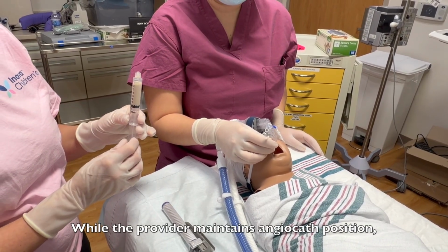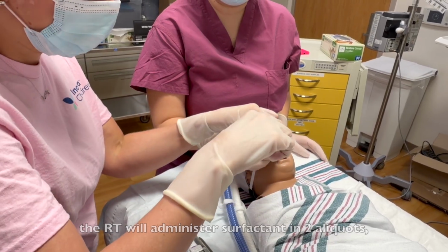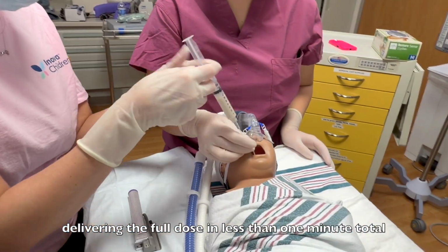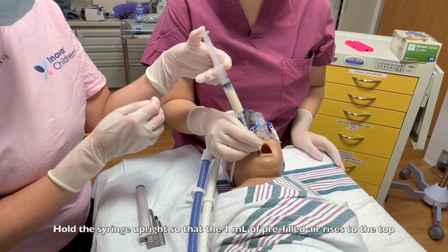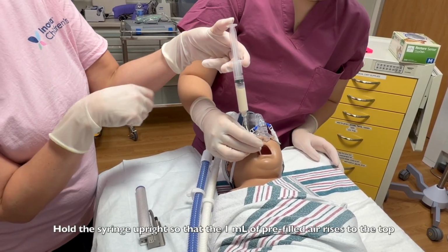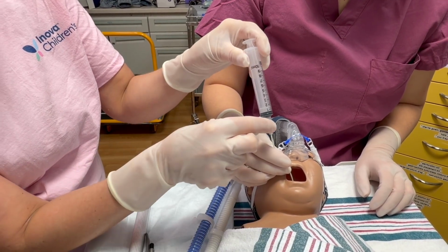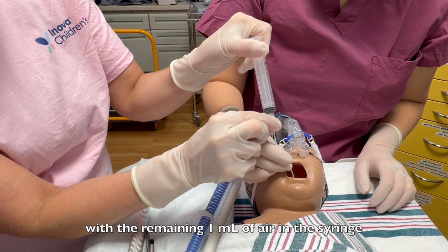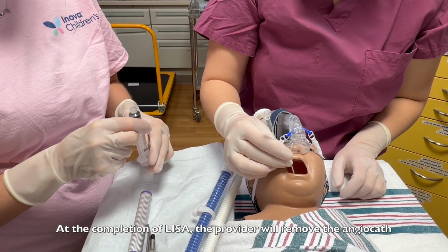While the provider maintains angiocath position, the RT will administer surfactant in 2 aliquots, delivering the full dose in less than 1 minute total. Hold the syringe upright so that the 1 ml of pre-filled air rises to the top. After surfactant is delivered, flush the angiocath with the remaining 1 ml of air in the syringe. At the completion of LISA, the provider will remove the angiocath.